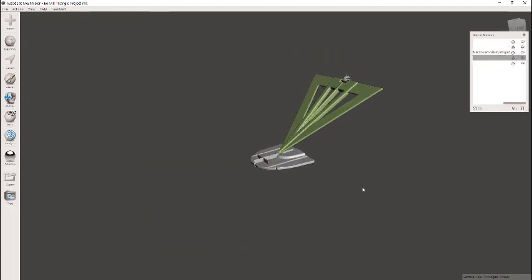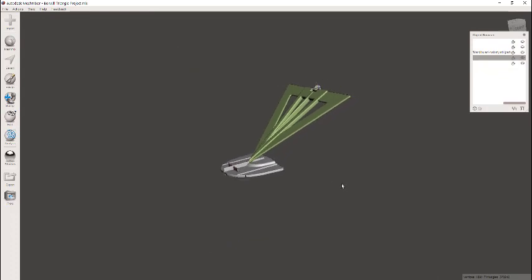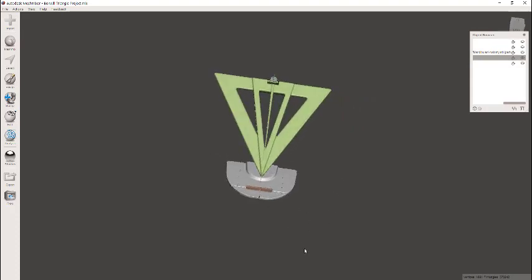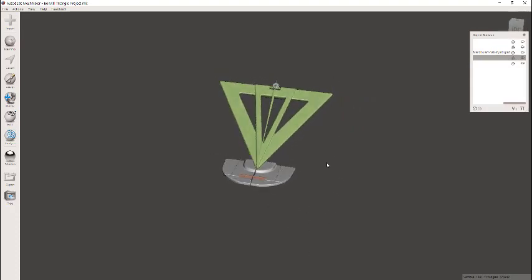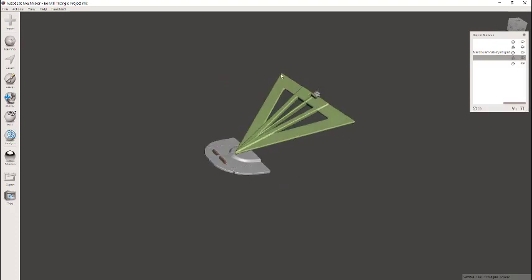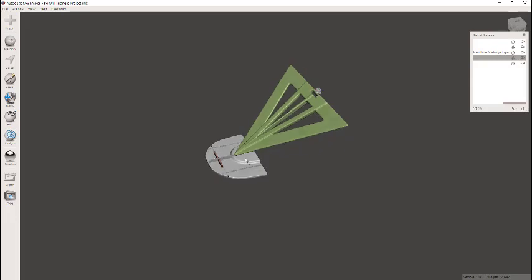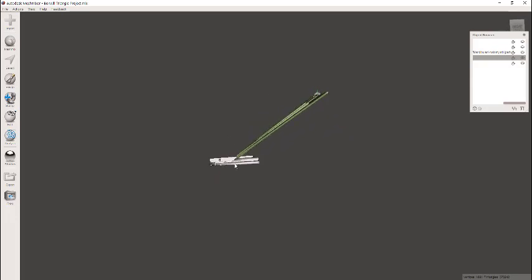This is the actual STL that you can see now that I've turned off the articulator and the models. Those are not part of it. That was just to help you visualize what the principle is. All this is a 4-inch equilateral Bonwill triangle, okay, with each of these representing the condyles. And again, you put the end point right here at the lower incisor midpoint.